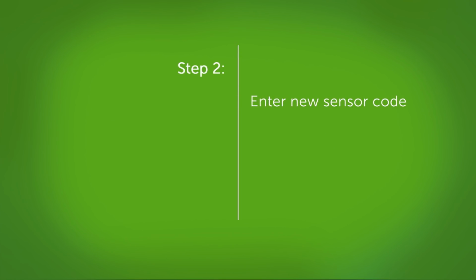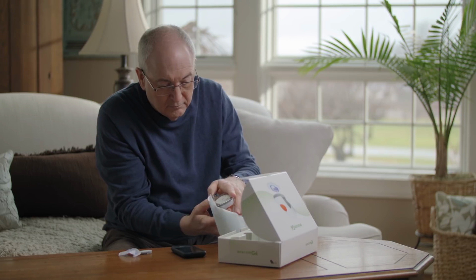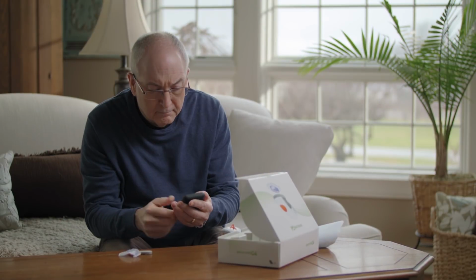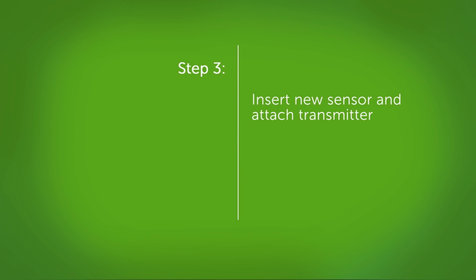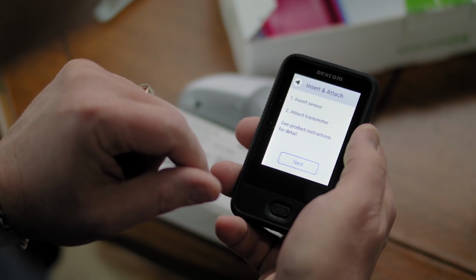Next, you will need to enter a new sensor code. You'll need to enter a new sensor code because the code is specific to each sensor. Grab a new sensor and enter the code. Confirm your sensor code, then tap Next. Now you need to insert your sensor and attach your transmitter. Remember, you need to insert the same sensor as the sensor code you just entered.